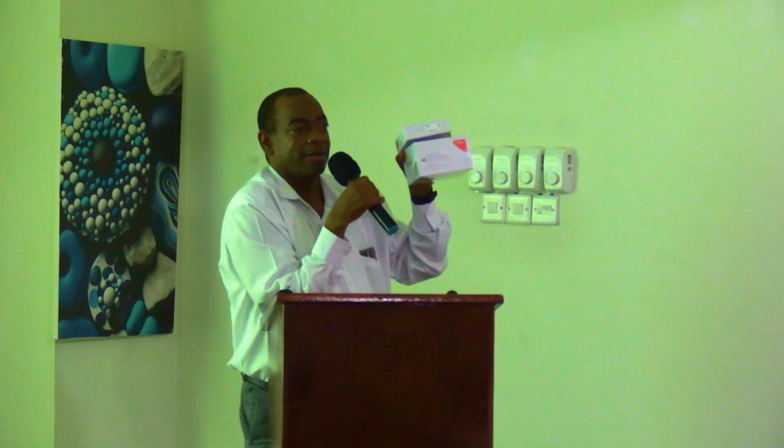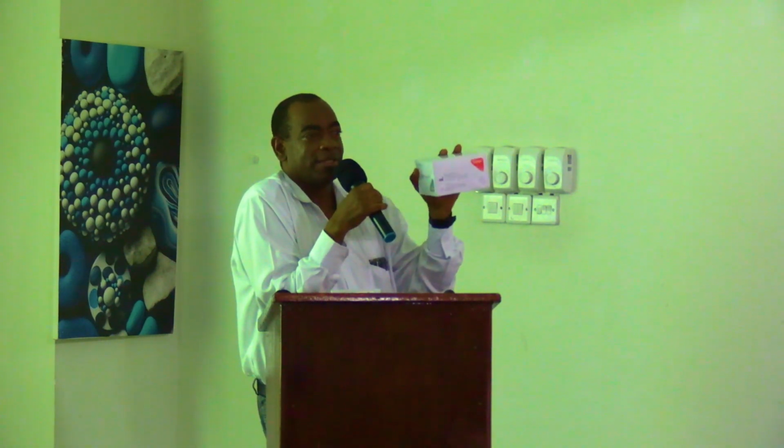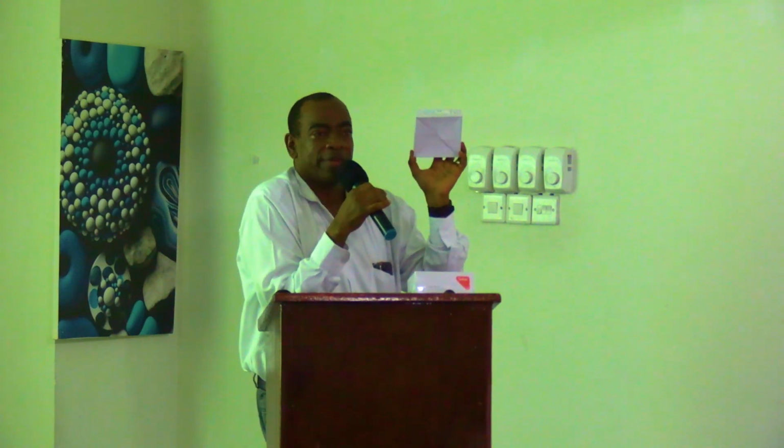There is a buffer and there is a cartridge. Is it not so? Most of them come in 2 boxes. So there is a smaller box with buffer, and we have a bigger box with what? Cartridge. What is inside the cartridge, in this box of the cartridge? ID chip? Insert and the cartridge. Yes. And in the smaller one? Buffer. So that's how we receive the kit.